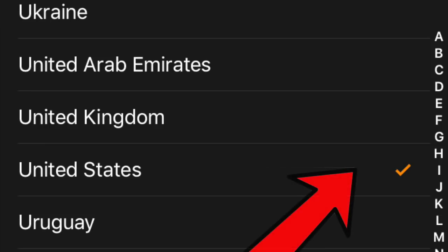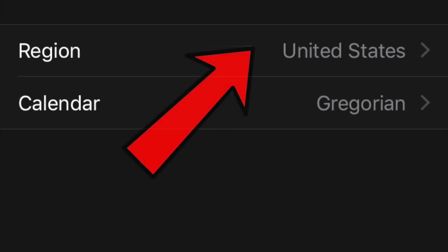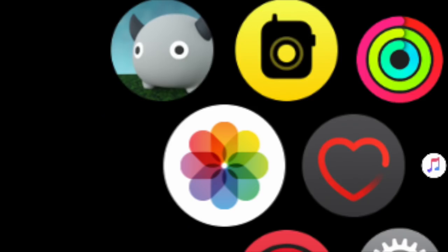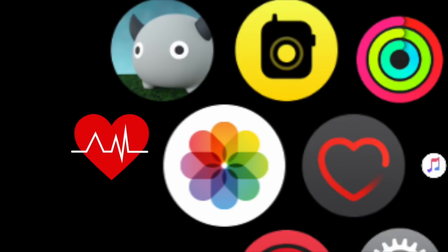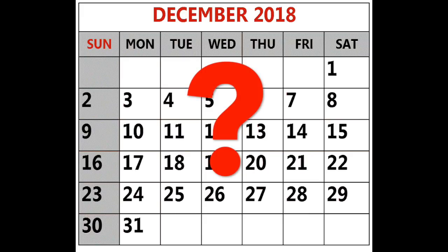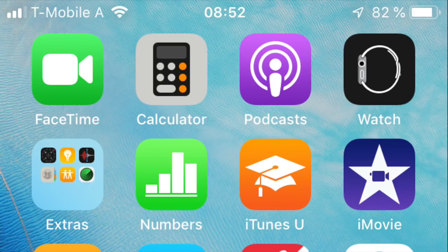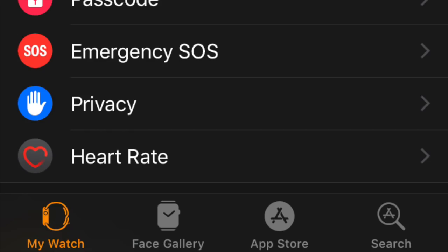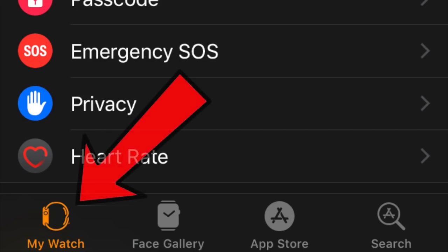Your iPhone will transfer the setting to your Apple Watch automatically, indicated by a quick notification on your Apple Watch. After the data is transferred, your ECG app should pop up on your home screen. Remember, this will only work after the app is released in the US later this year.